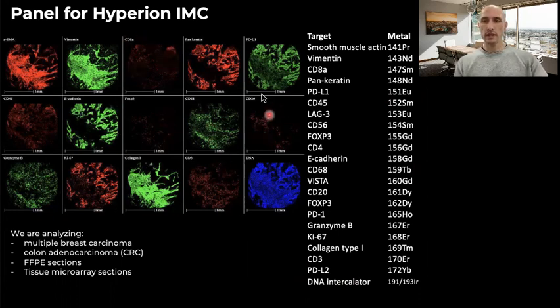The cores here are all from the same patient, so this is only one patient sample. The results are for some of the positive markers we found in this patient. Each of the markers you are seeing here is a very small snapshot, ranging from architectural markers like SMA to immune markers like CD8 or FOXP in this core.